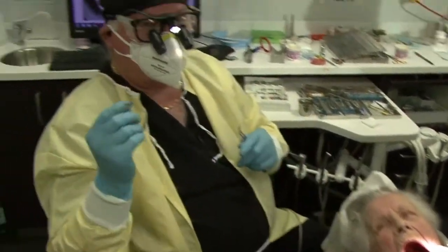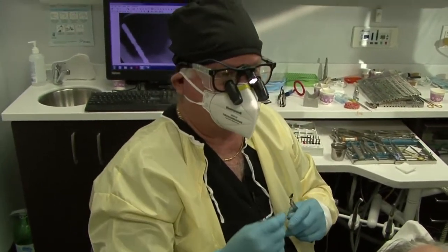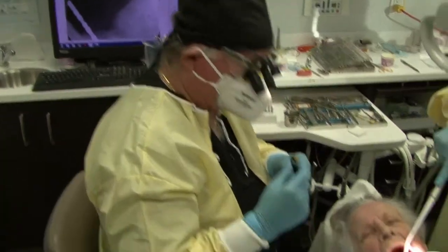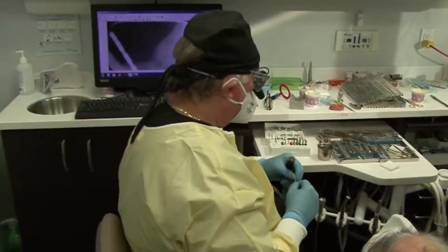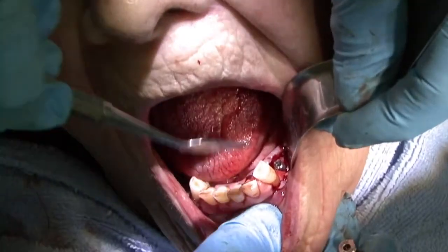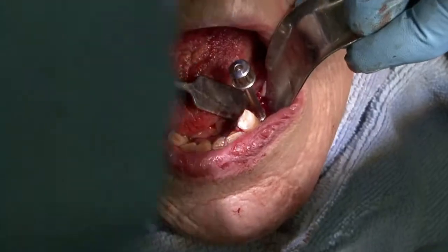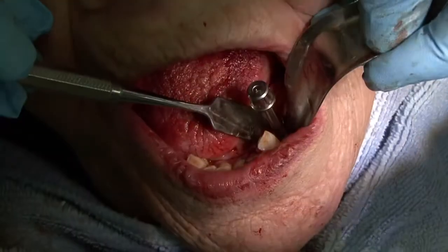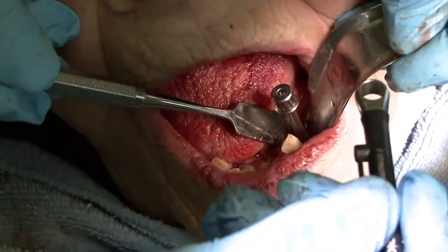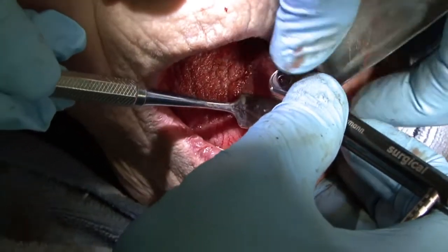That went in a little bit further because this was a previous extraction site, so the bone is a lot softer. But there's still enough that we can ratchet further. Can you see how much is sticking out? Yeah. And you can still see that we're parallel. I haven't got my level with me, but I think it was pretty parallel.